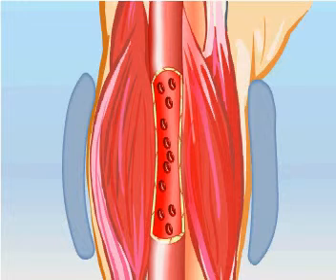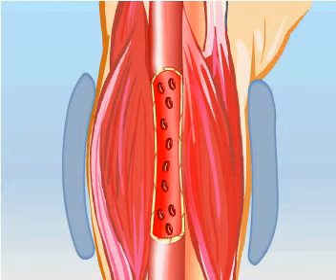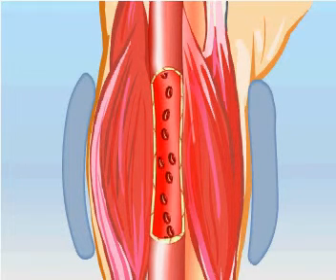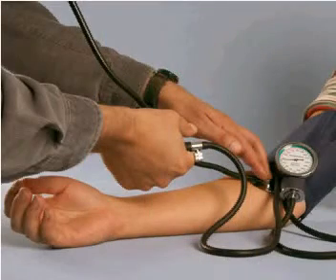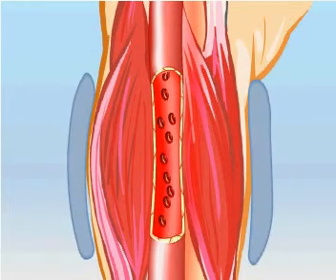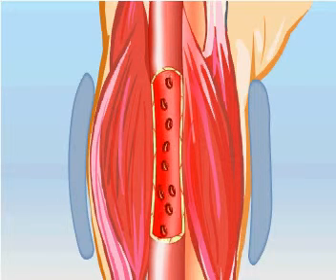Then, the pulse disappears for a short period of heart diastole because the blood pressure decreases below that in the cuff. So, rhythmic systolic tones broken by diastolic periods of silence can be heard at this time. Further decrease of pressure in the cuff causes these rhythmic sounds to disappear finally. It is done when the pressure in the cuff is equal to that within the artery during diastole.